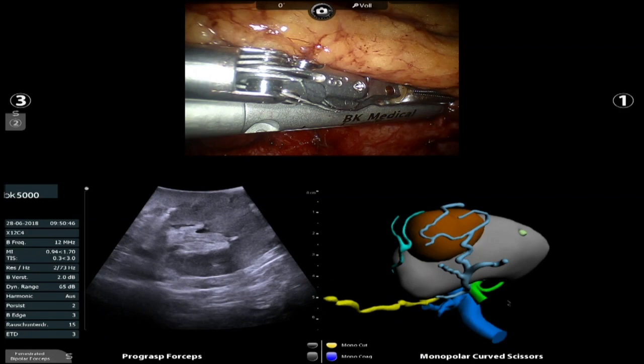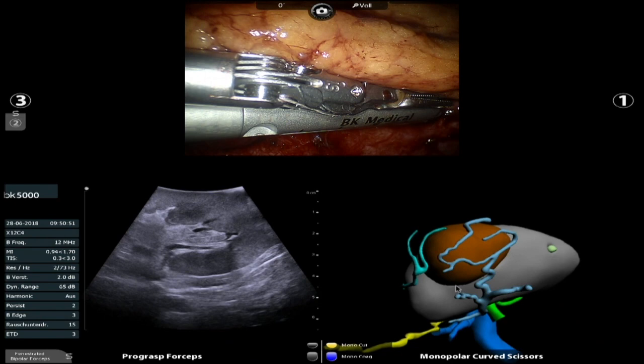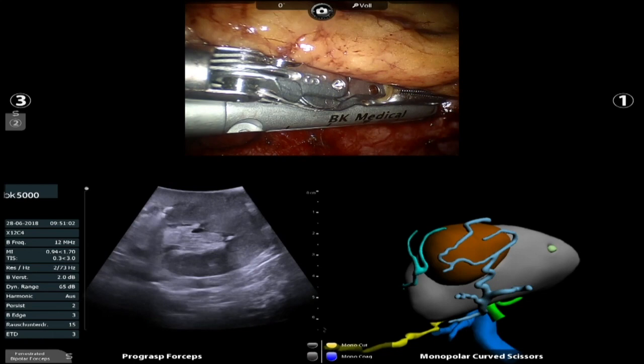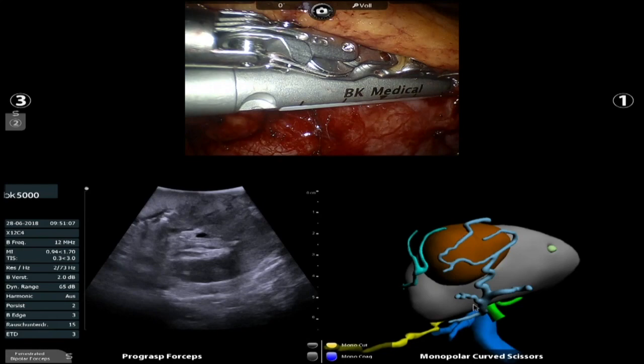Can you look with Doppler, with this ultrasound probe, so you can see the vessels? Yeah, we see it nicely. The Doppler doesn't matter. I don't care about that. That's a tumor. That's a vessel. I mean, that's a tumor. But that's a projection there. So this is not a smooth bottom to the tumor. And that's what I was worried about on the CT scan. And interestingly, the reconstructions don't show that.